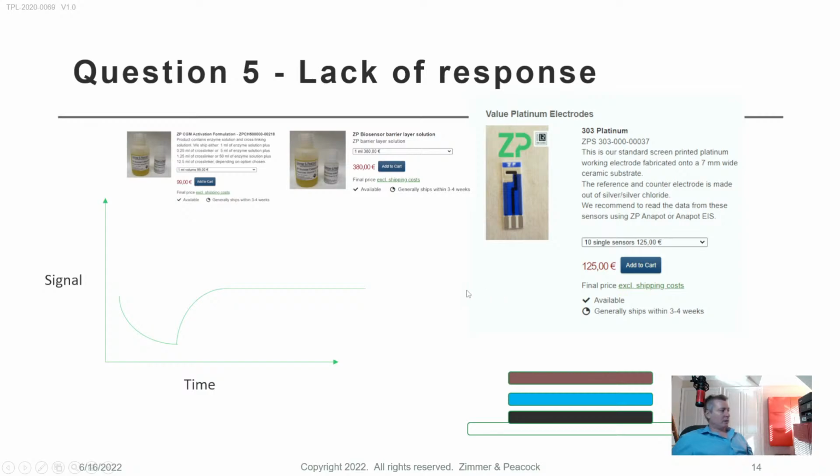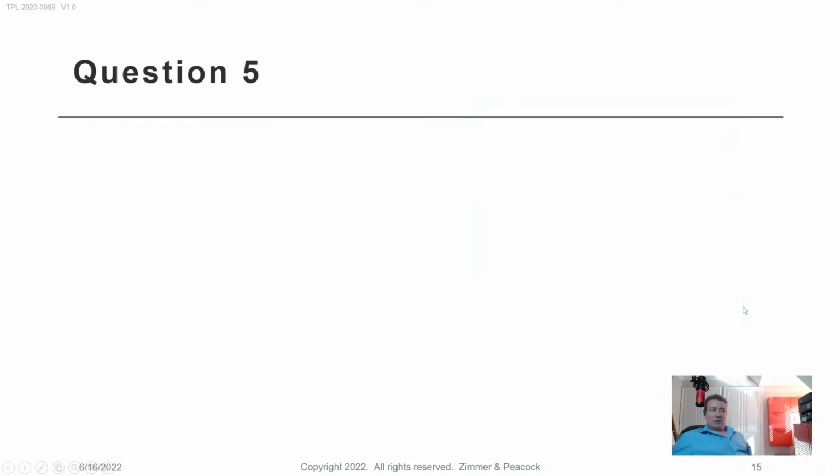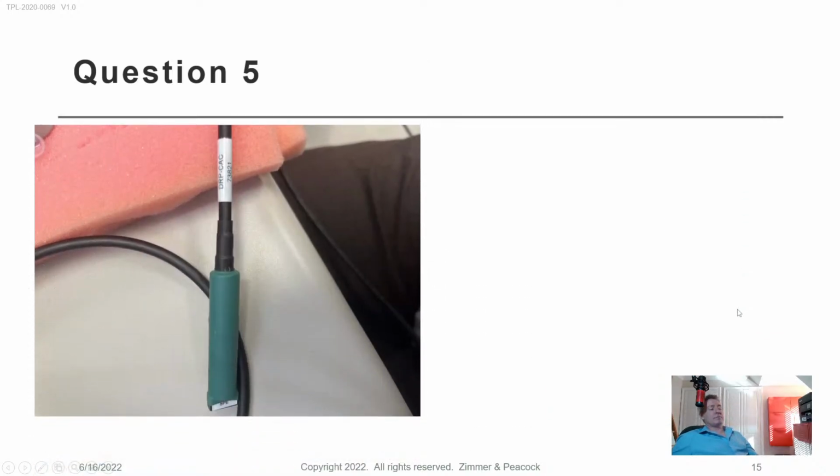If you Google and look through the literature, generation 1 glucose sensors are generally made on platinum electrodes. A data point on that is that Dexcom, which makes a CGM, uses platinum, and Medtronic, who also make a CGM, a continuous glucose monitor, I think are using platinum black. So I also have some understanding from the commercial landscape that platinum is the one used, and we do use it as well.